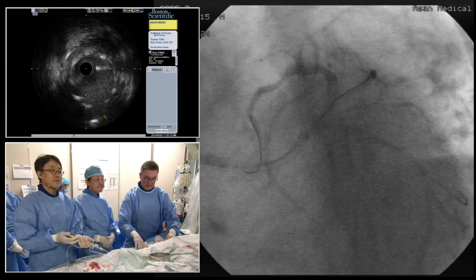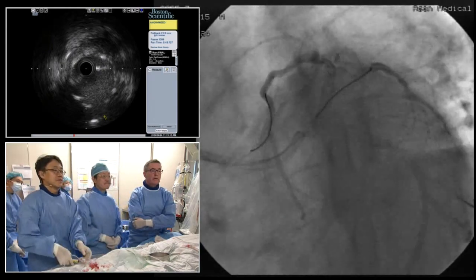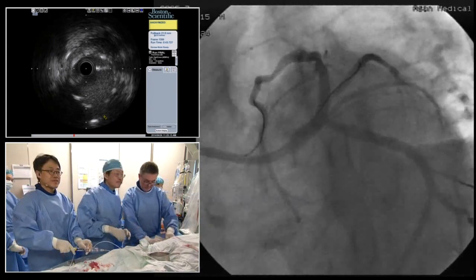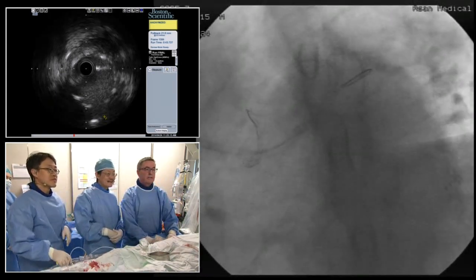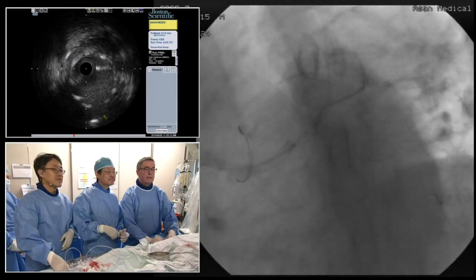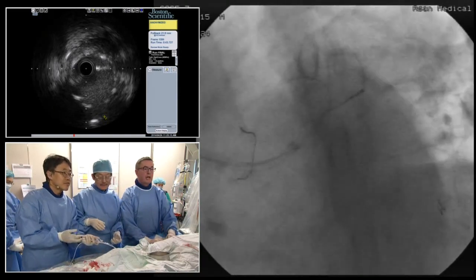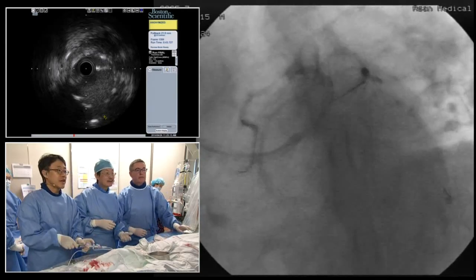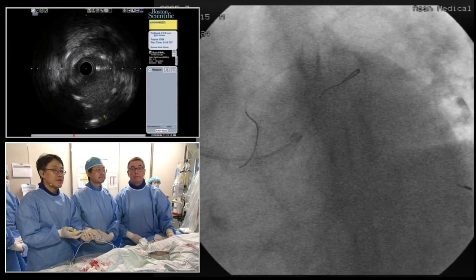Is it better to advance the diagonal wire more distally? Because to have a good angle. Oh yes, we can certainly do that. To my eye, it's looking better. So it's wired distally. I think it looks better now. Yep, it's wired distally in the diagonal. It's just folding over towards you. So let's have a look. You ready? Okay. Beautiful.